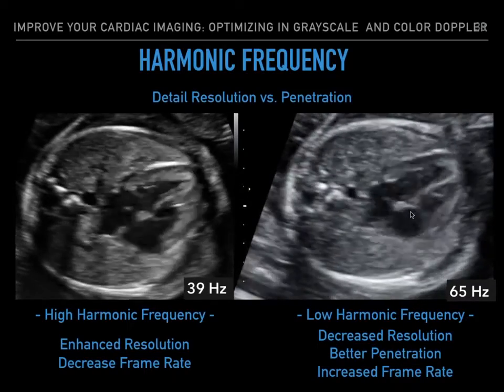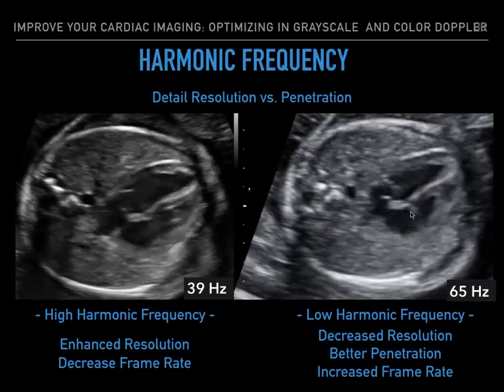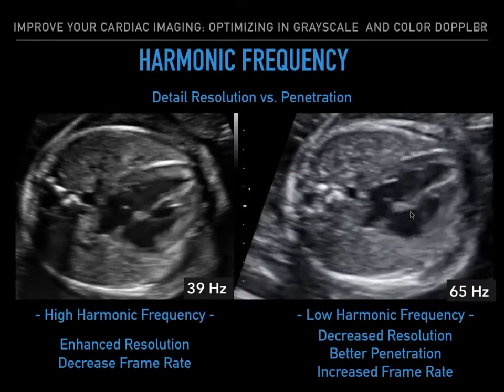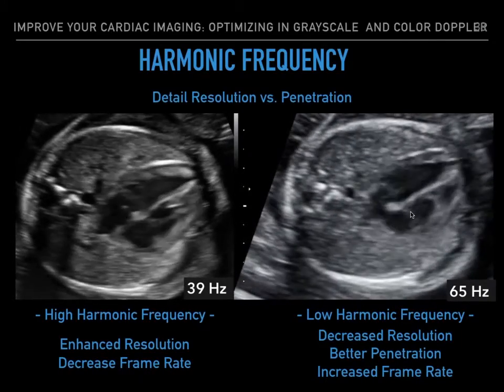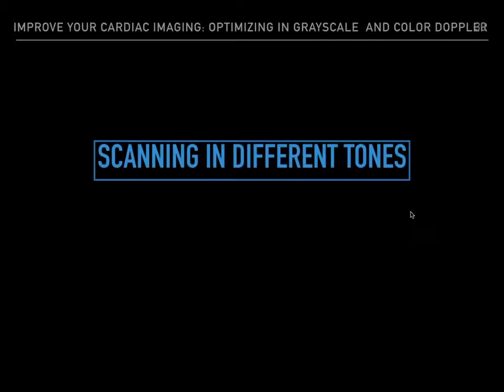This actually decreases the enhanced resolution, yet we do have better penetration of the heart and an increased frame rate of 65 hertz, which is ideal for fetal cardiac screening. So again, it just depends what you're looking for, detail resolution versus penetration. Scanning in different tones.